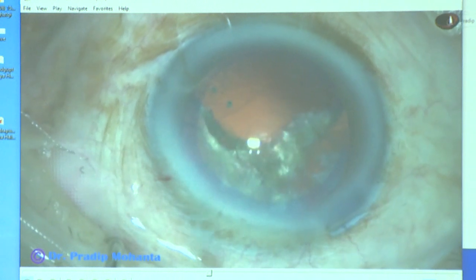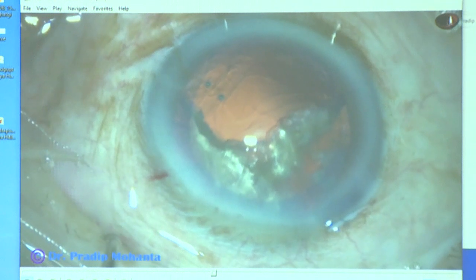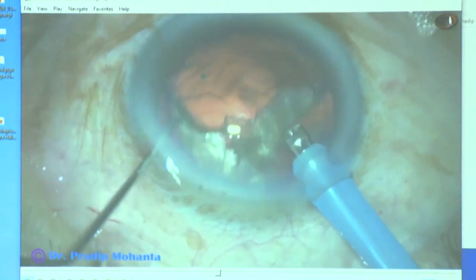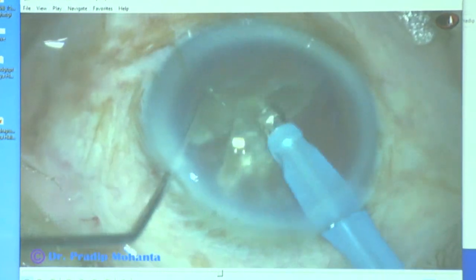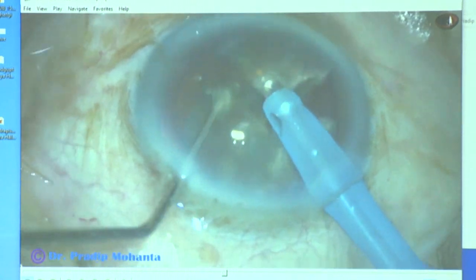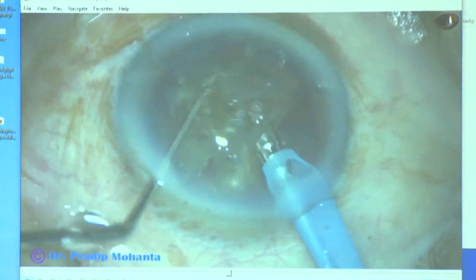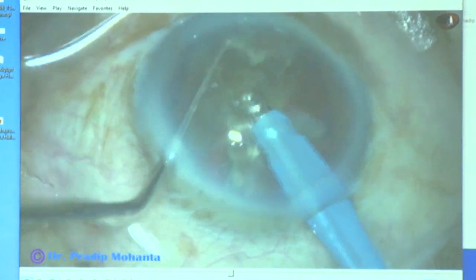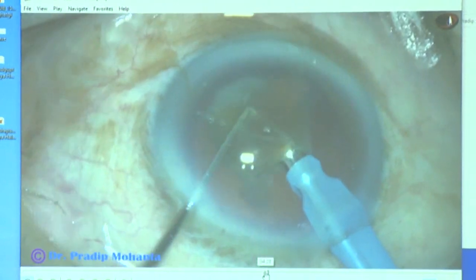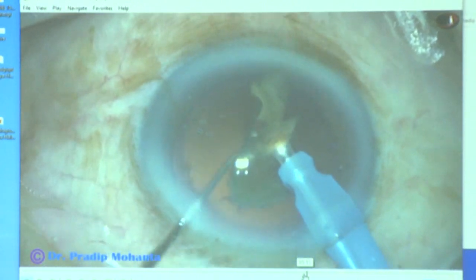I come out after managing half of the nucleus, inject more visco to protect the corneal endothelium, and now go again, and I come to the smaller heminucleus, divide it into two parts, and emulsify this. And this happens most of the time. Most of the time we can manage like this. But what if we cannot manage like this? What if we cannot crack the nucleus in one go?